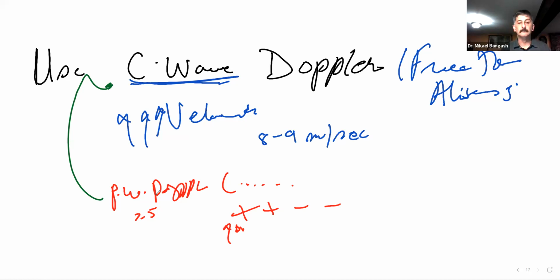We could even do, as I just said, a shift, or scan the vessel from a shallower depth of view.